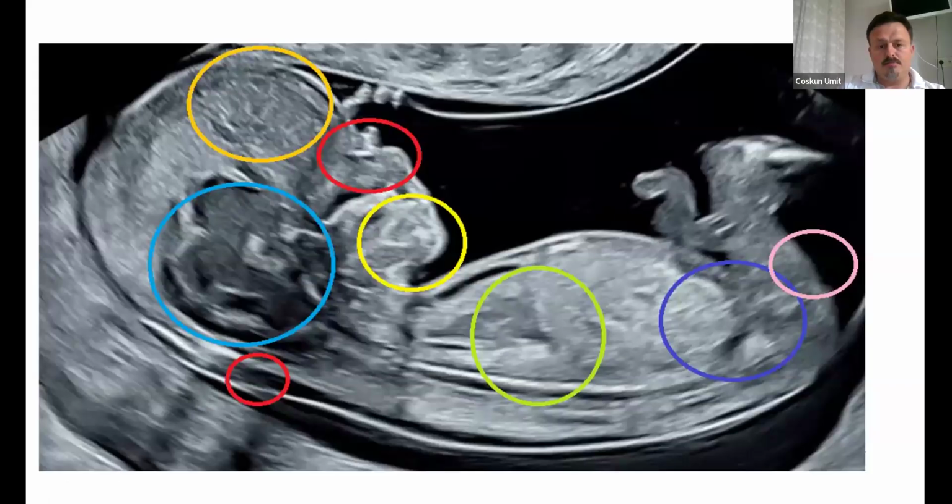And this picture is very important for me because you can check many structures and many organs in one plane. This is not only an NT plane. You can check also intracranial structures like thalamus, midbrain, brainstem, IT, cisterna magna, and nuchal translucency, and forehead, and some face angles.